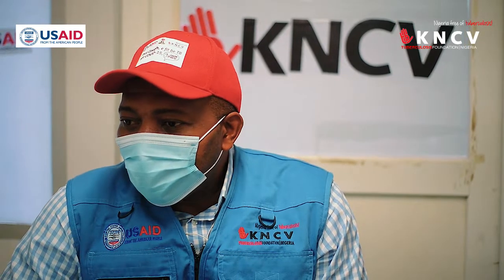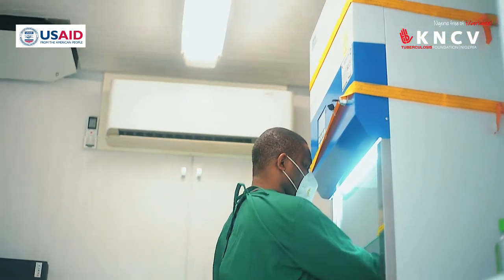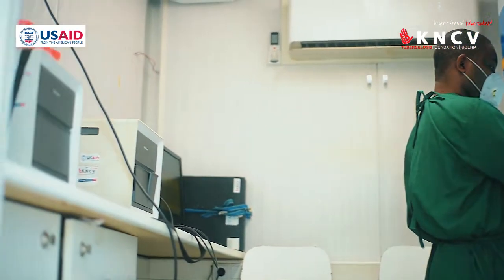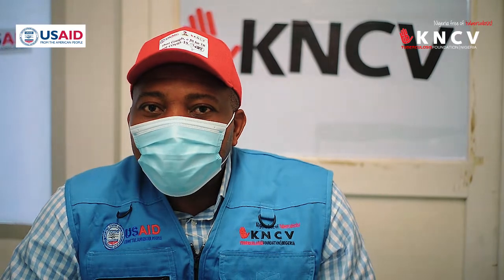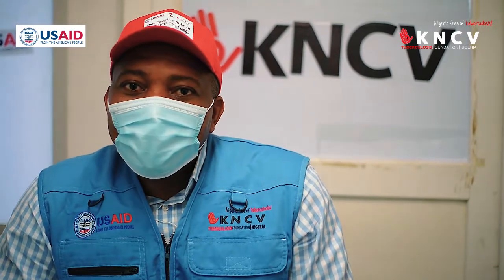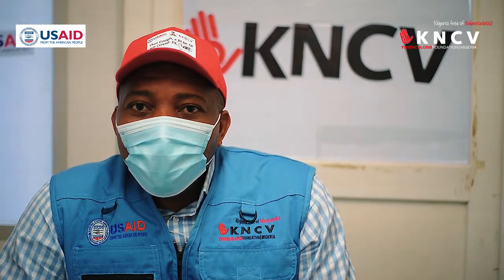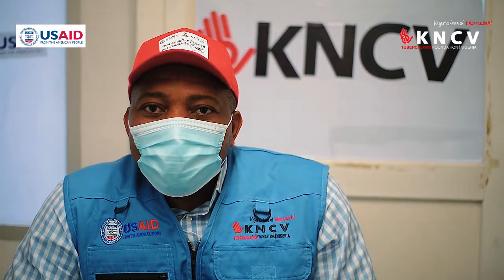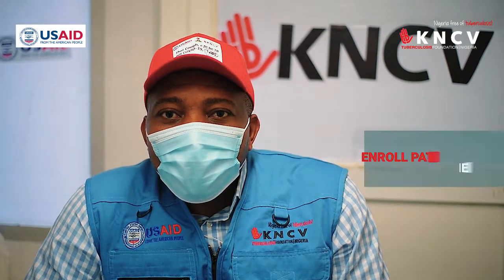The compartment where we are presently is the laboratory section of the Southern WoW Truck, and is a restricted area for the laboratory staff alone, because this is a potentially infectious area. I'm going to quickly talk you through our processes. Our activities in the Southern WoW Truck are basically what we call the cascade in active TB case finding in communities. I'll start from the first point in our cascade, which is what we call the enrollment.